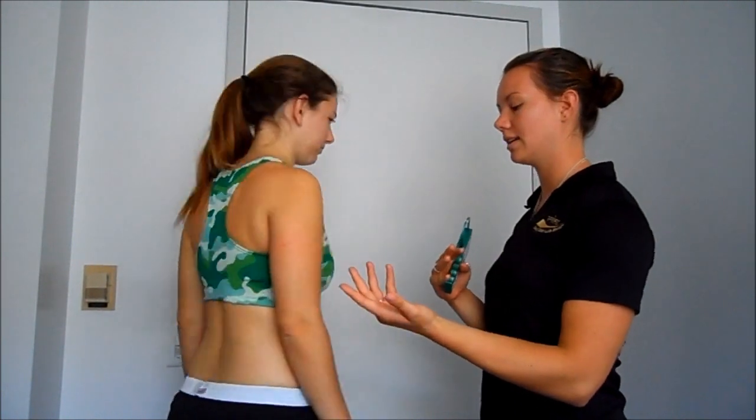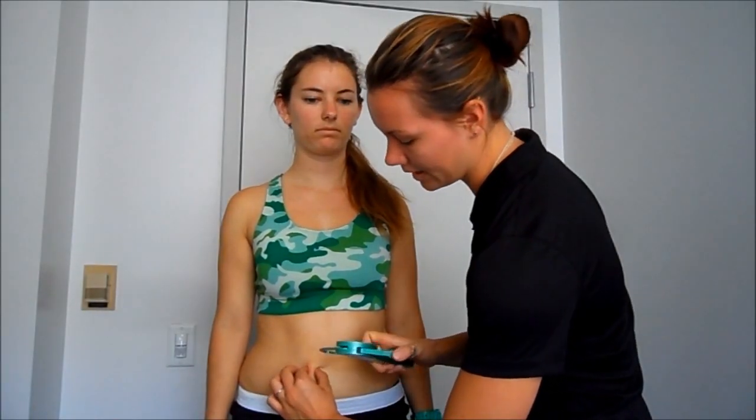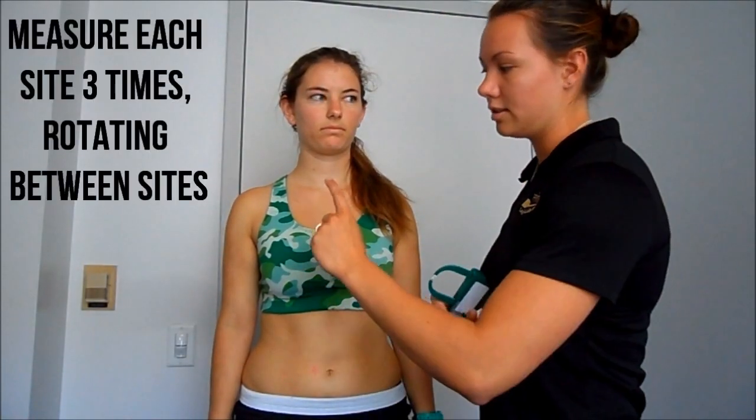You'll ask the client to turn around and continue on the next two sets. A couple of pinches — pull the skin out, open the caliper, place it at the base, take your reading, open it again, and take it away from the client. You'll do each site three times, rotating between the three.